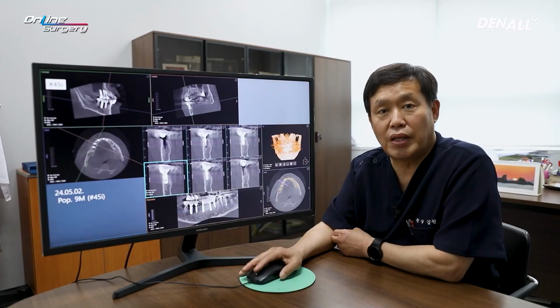In the surgical clip, when surgery was done in the lower anterior zone, students from the dental university came on an excursion, so I was providing explanation to them, and you'll be able to listen in. Let's look at the clip.